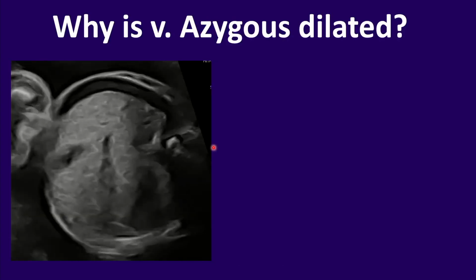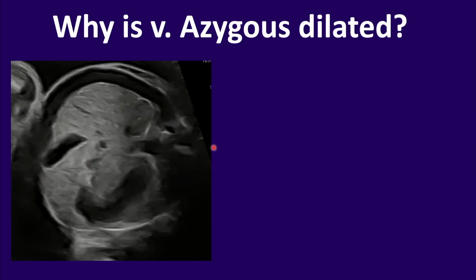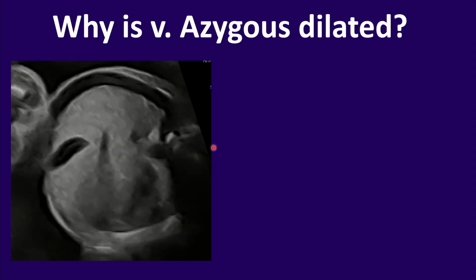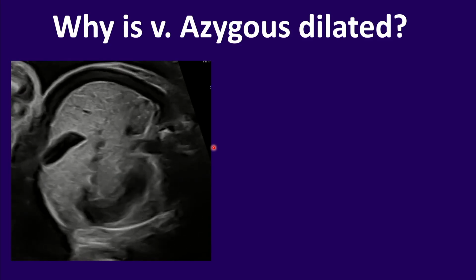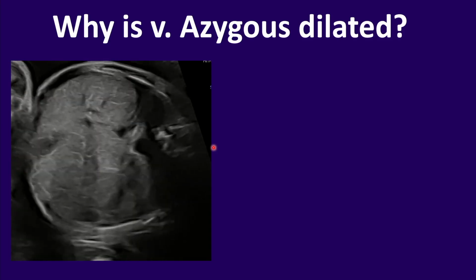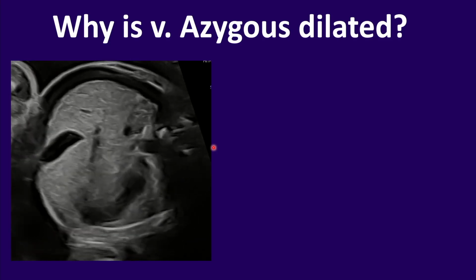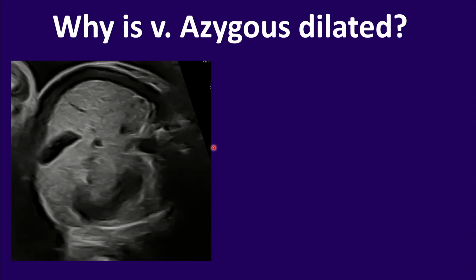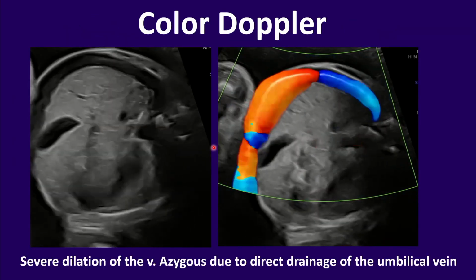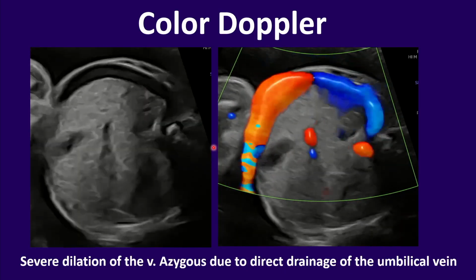But whether it's preserved cardiac function or not, this is our upper abdominal level. So what do we see here? Ascites. Let's vote. Who thinks it's ascites? Okay, who thinks that we probably need more information? How can we get more information? When something looks abnormal on 2D, the next step is to add color. And we did. What do you think now? Is it ascites? No. What is it?